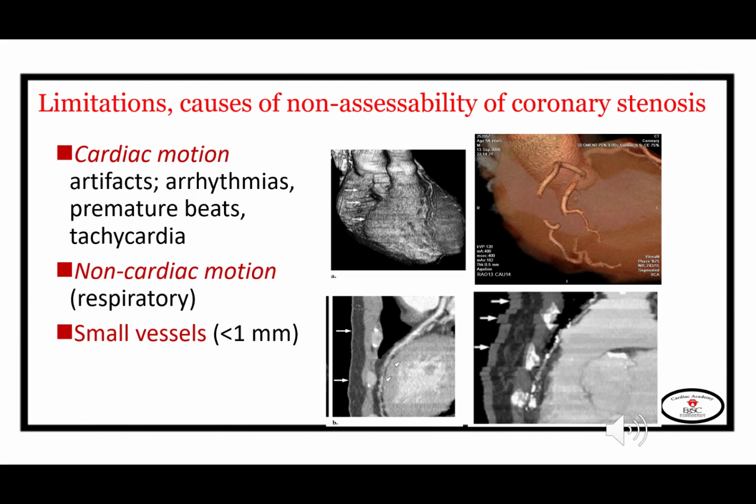Small vessels less than 1 millimeter, due to the limited spatial resolution of cardiac CT, are sometimes uninterpretable.